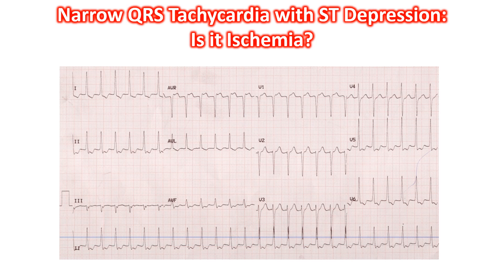A narrow QRS tachycardia is seen at a rate of around 150 per minute. ST segment depression is seen in inferior and lateral leads, with T wave inversion in leads I, aVL, and V6.